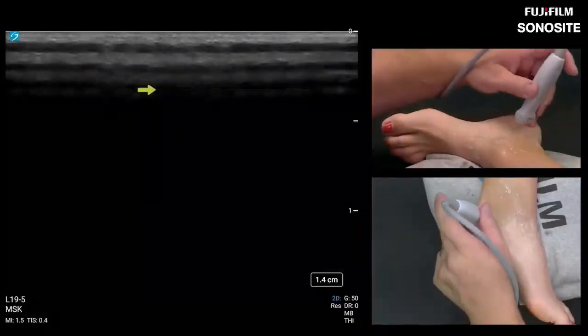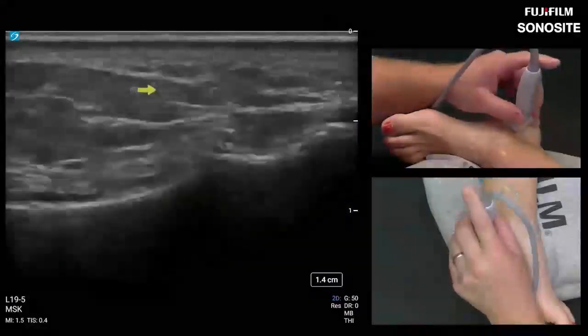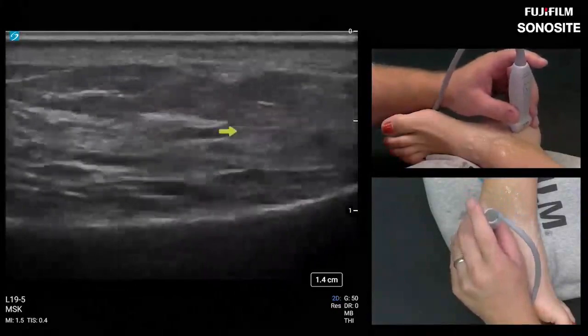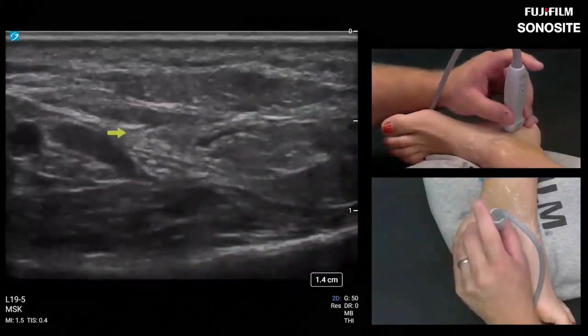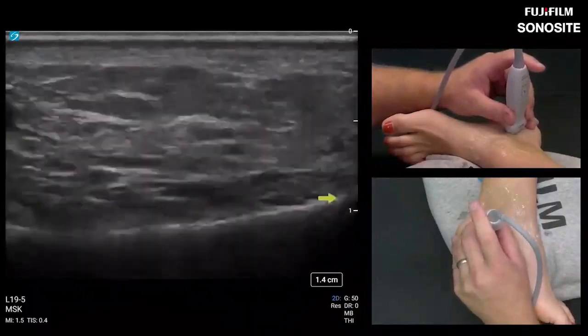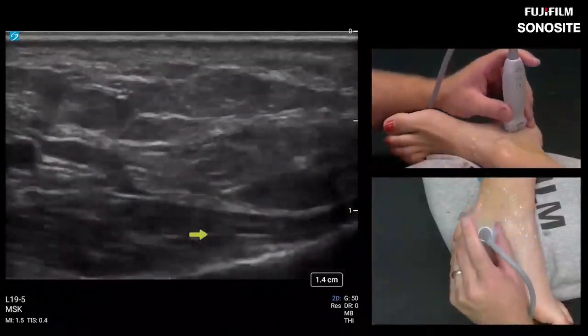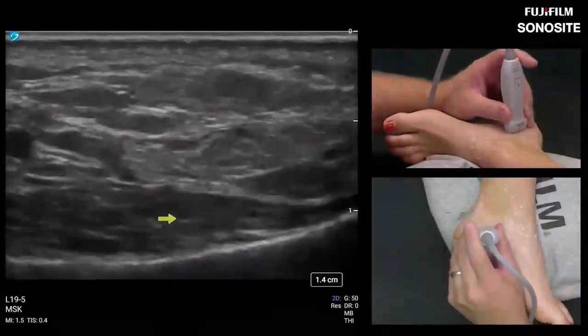I'm going to keep my finger down on the calcaneus. There we go. So calcaneus, here we are, and here's that flexor retinaculum diving down to just about the tubercle level of the calcaneus. But just deep to that is our quadratus plantae muscle down here.